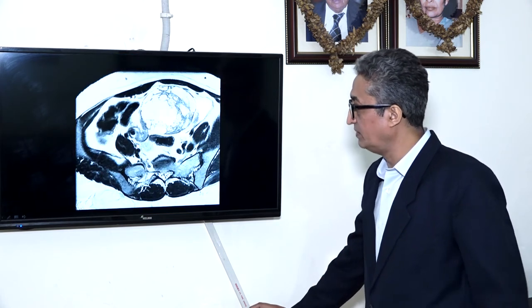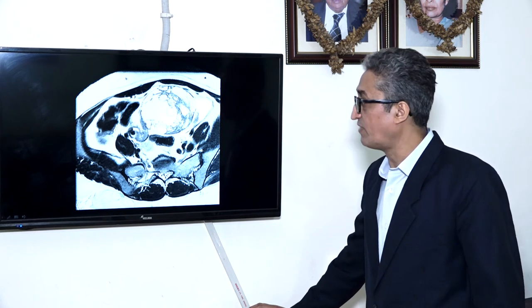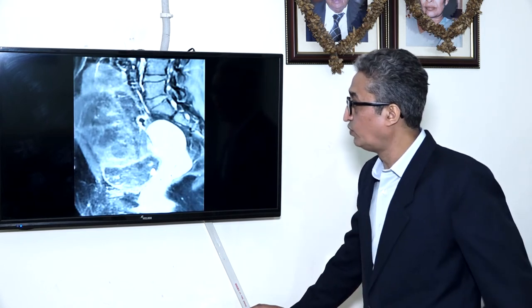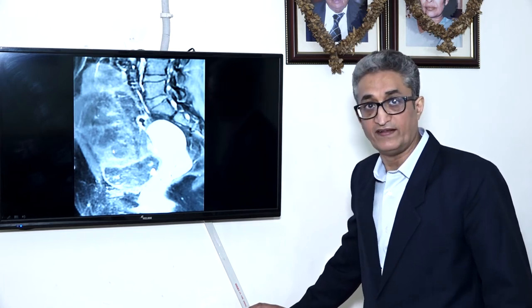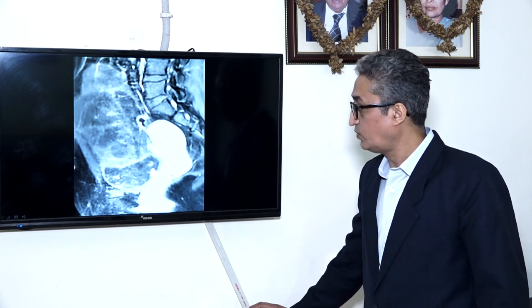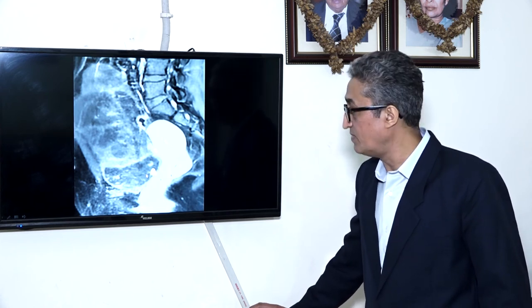On the sagittal T2 weighted image, we can see a complex multicystic mass in the pelvis. On the axial T2 weighted image, we can see a bulky twisted right pedicle, also known as the whirlpool sign. IV contrast was given. On this T1 sagittal post-contrast image, the mass shows lack of contrast enhancement, enhancement of the uterus is visualized, and a small amount of contrast is seen in the urinary bladder.